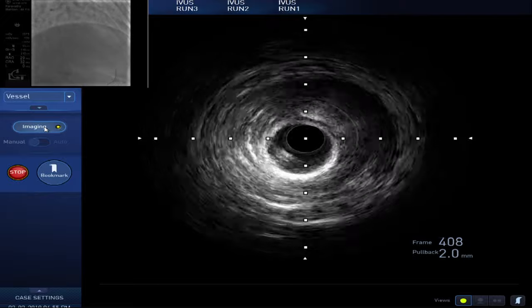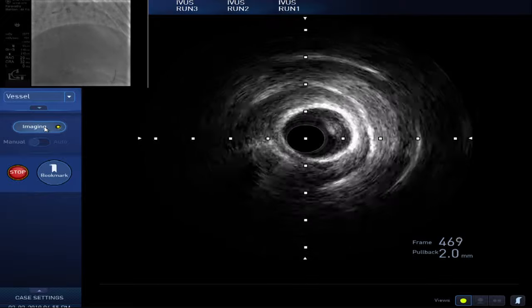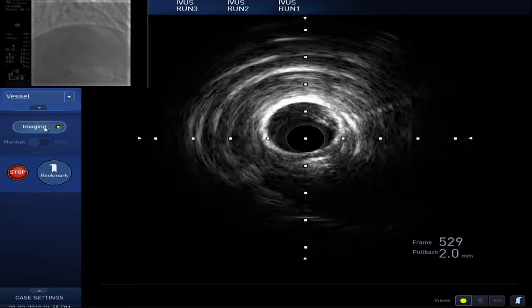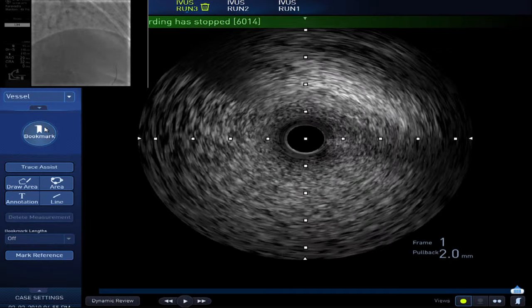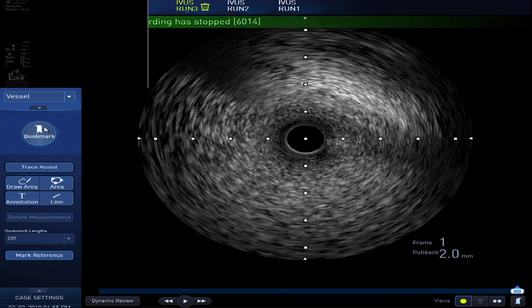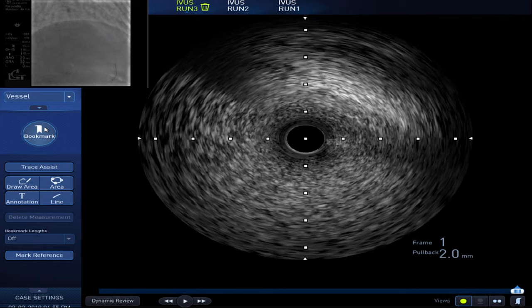I think it's just a guide. This thing in, just not in it. Let me see, just take it out. So what do you think? I don't know yet. Hold on one second. Let's just make sure there's no clot or something. Is there a pressure, aortic pressure? Well, it's not yet. There's no pressure. Maybe a clot.